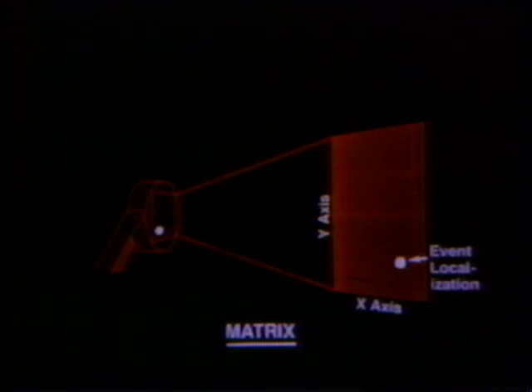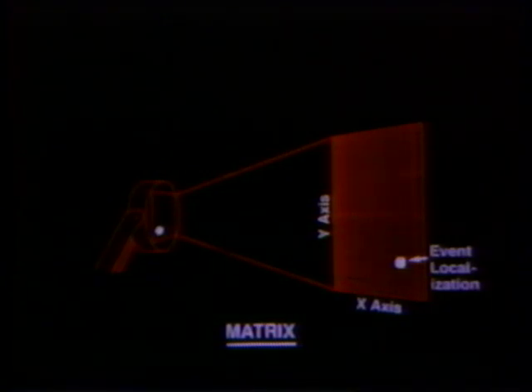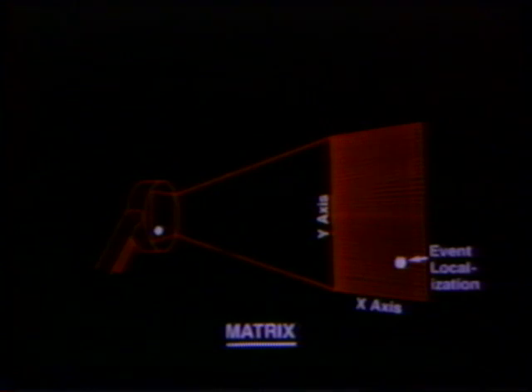The question is, how fine or coarse a grid do we use? The size of the matrix is variable within the computer. For some studies, we use a grid that has 4,096 separate boxes in it. Since we said it was a square grid, this means it must have 64 boxes on a side. 64 times 64 equals 4096. This type of matrix is called a 64 by 64 matrix and is written 64 × 64.